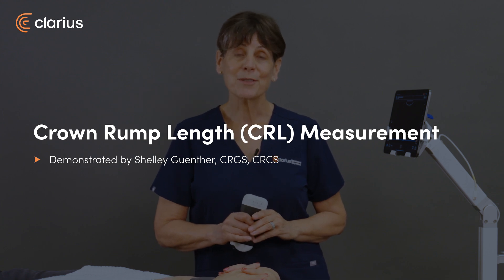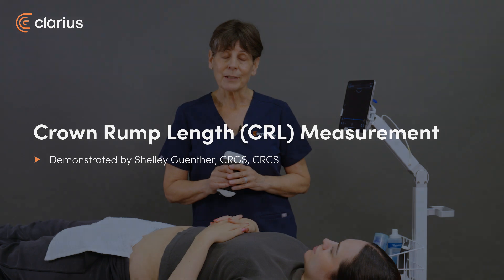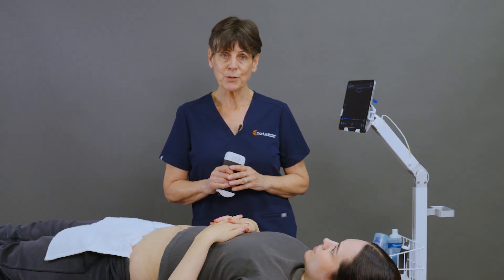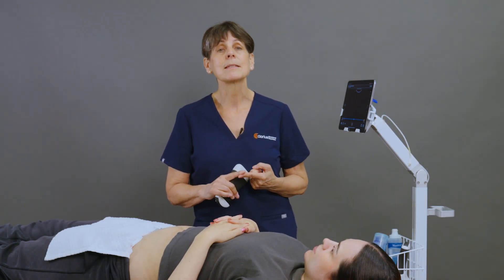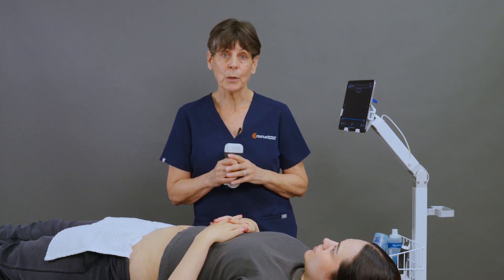Hi, my name's Shelley and today we're going to measure the crown rump length in a first trimester pregnancy. Dating ultrasound anytime after about six weeks menstrual age is really important because number one, it helps us establish a due date, and number two, we can then monitor growth throughout the pregnancy.